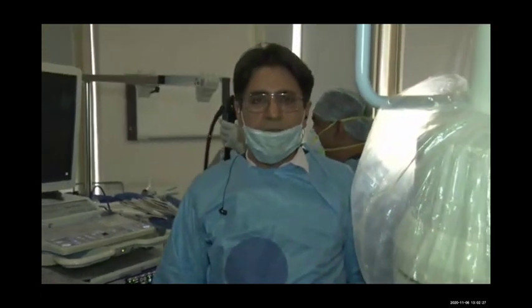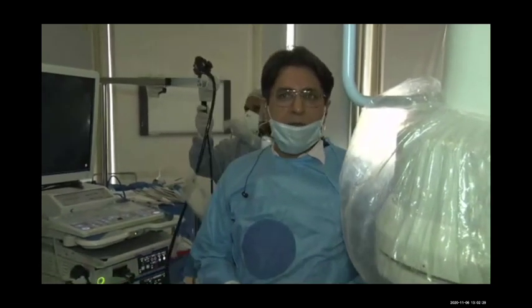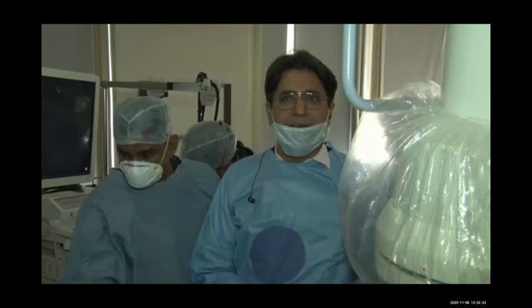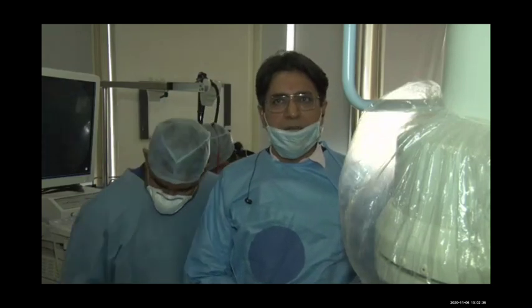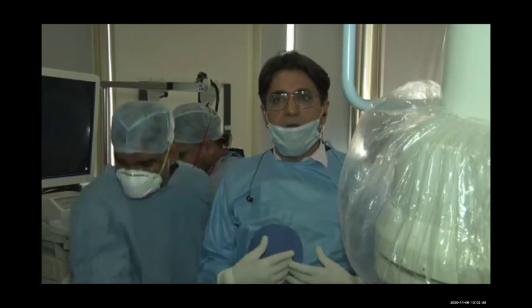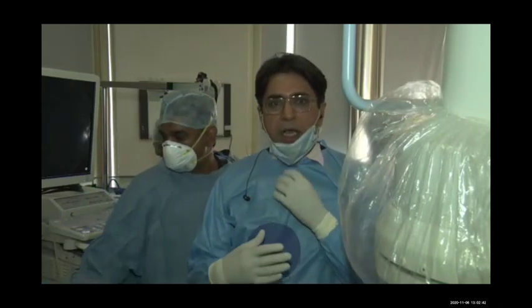The question comes, why EUS guided? The options are either we do endoscopic guided glue injection. The problem with the endoscopic glue, one is failure. The patient is from a distant place, and sometimes with the endoscopy you may not be able to obliterate. You don't see the complete obliteration.